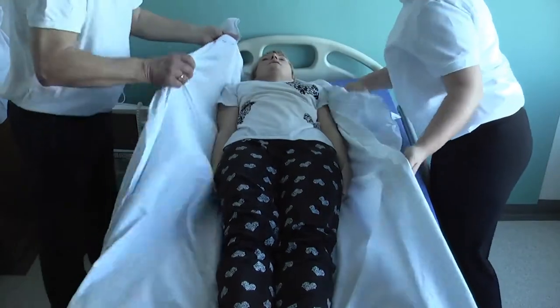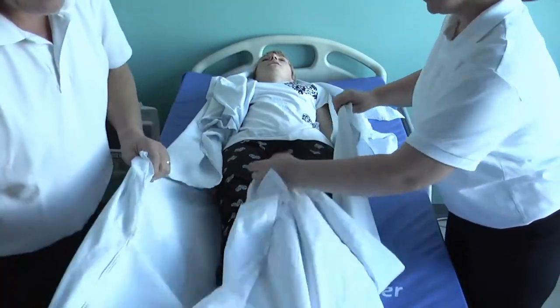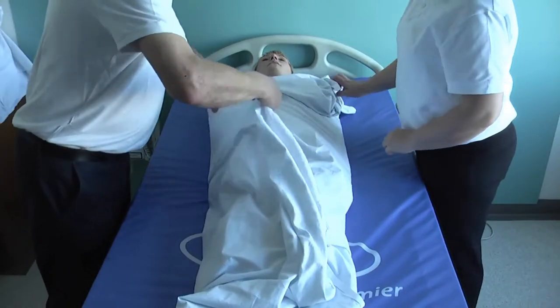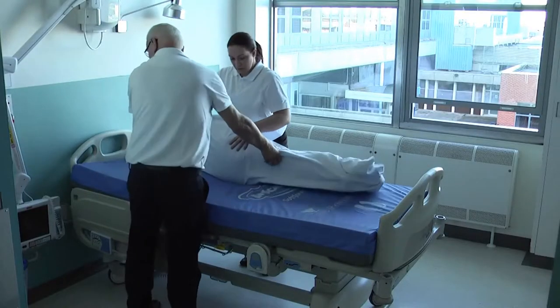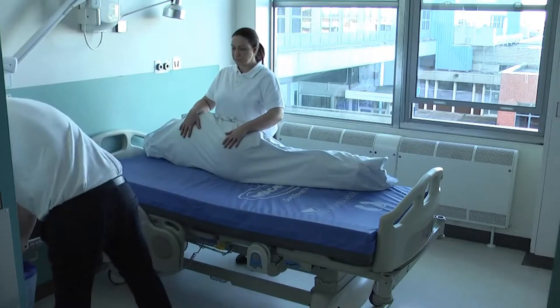Wrap them in the bottom bed sheet. This will help to keep the user secure during the transfer onto the ski slide pad and adds a layer of warmth during the evacuation process. Roll them onto their side, ensuring they are fully supported.